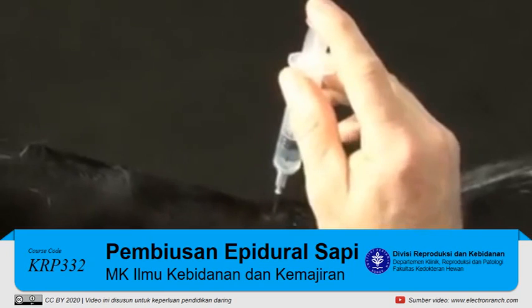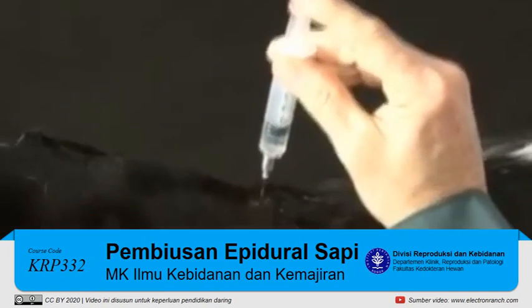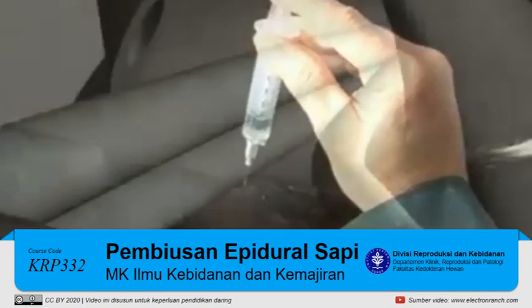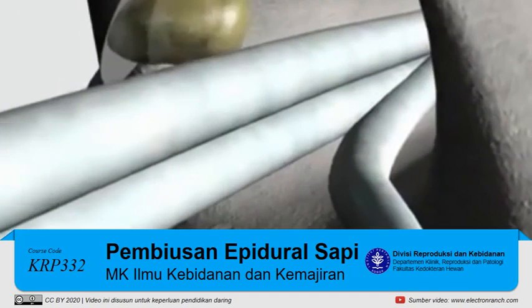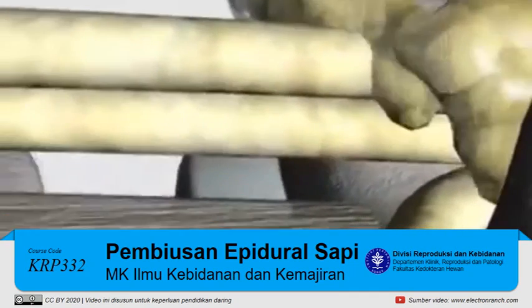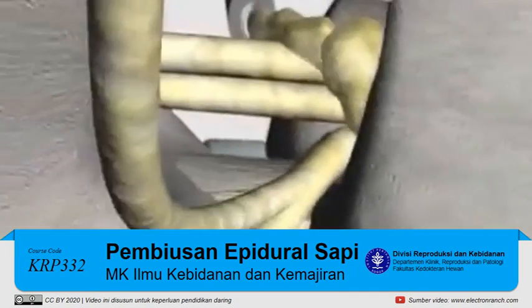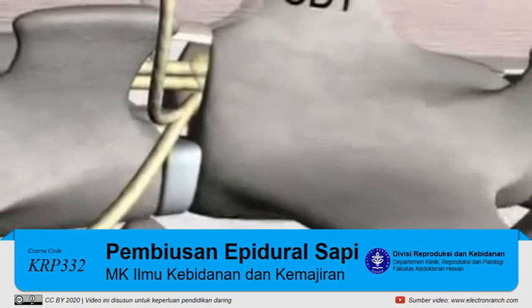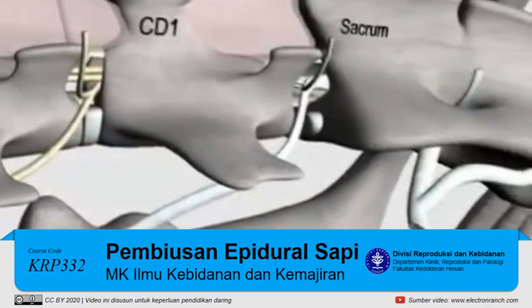Once you have confirmed proper placement, attach the syringe and administer the anesthetic. You should encounter no resistance during the injection. The anesthetic will fill the epidural space and diffuse cranially, anesthetizing the nerve roots as they emerge from the sacral spinal cord.